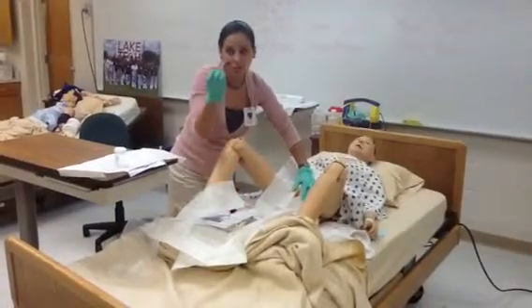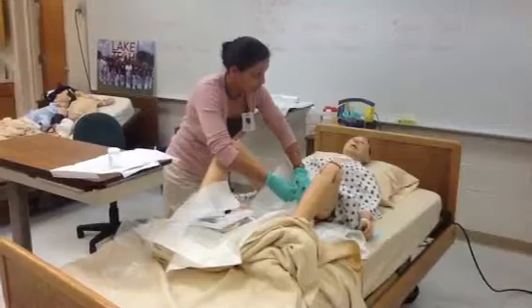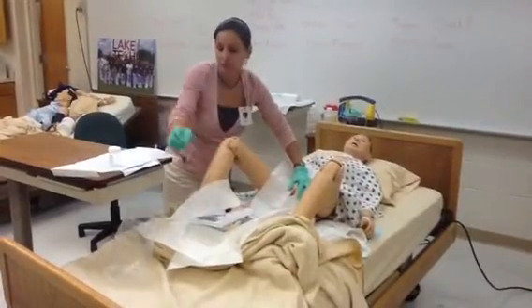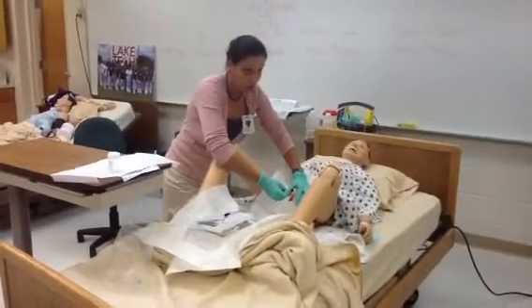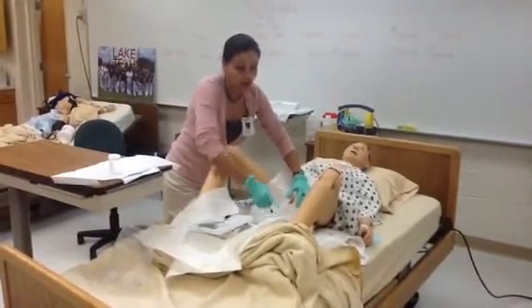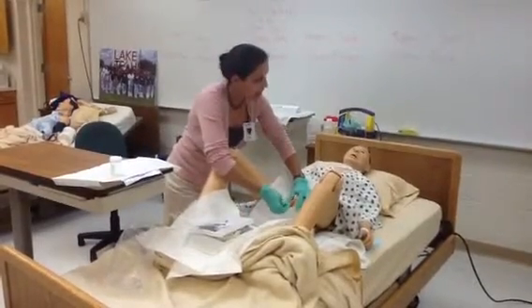You will take one swab from away from you, from the top to the bottom, and discard. The next swab will be close to you from the top to the bottom. One swipe. And the last swab will go straight down the middle.